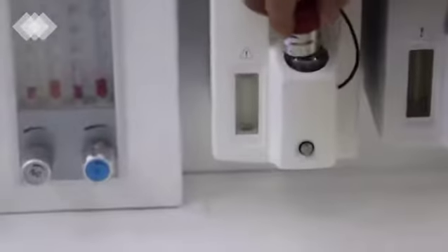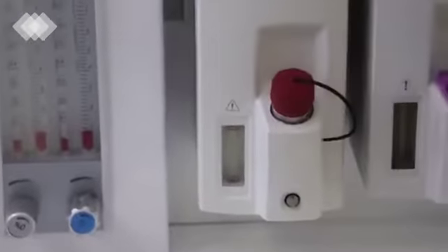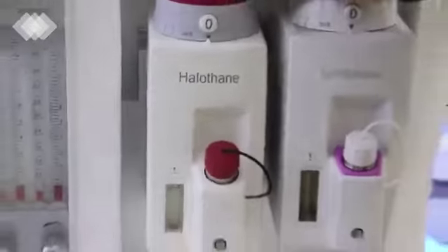Once we need to pour in the anesthetic medicine, just rotate this button and pour in the medicine, and then just lock it again. And also between these two vaporizers, there's an automatic lock. It means once you use one of the vaporizers, the other one can never be used. It's to ensure safety.